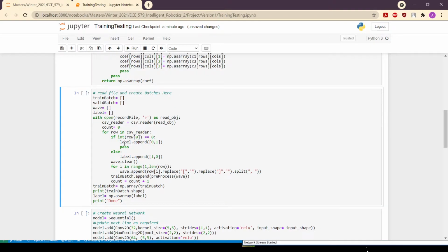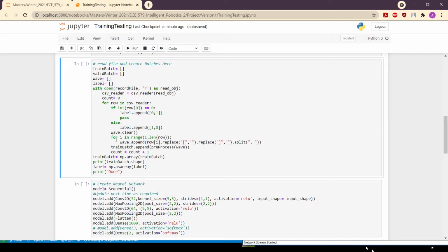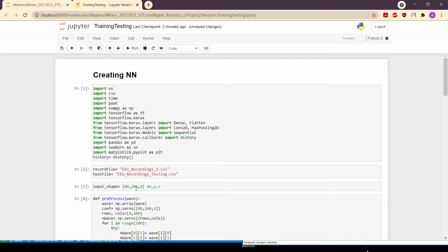So here we create the training batch. I will open the recorded file, get that information, and transform it with the continuous wavelet transformation using this function, and then start training a neural network model. Here I'm using a convolutional neural network with input size of 80 by 200.